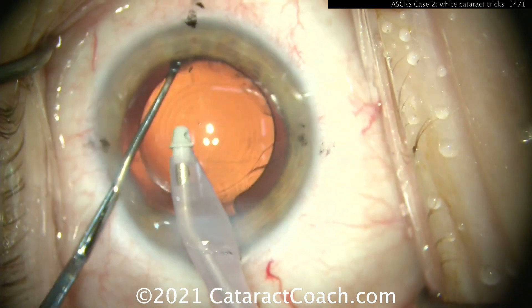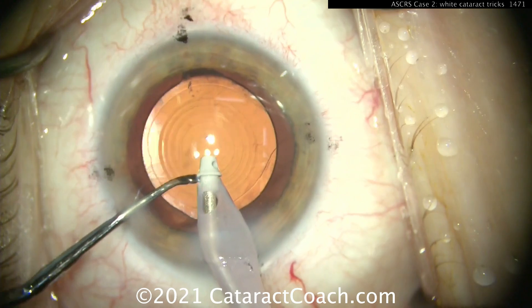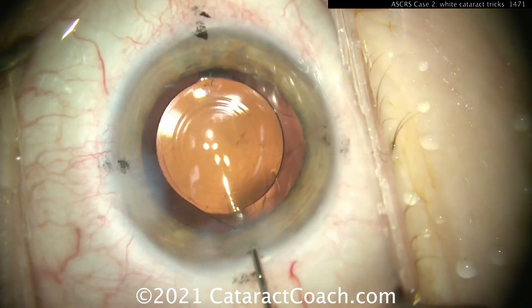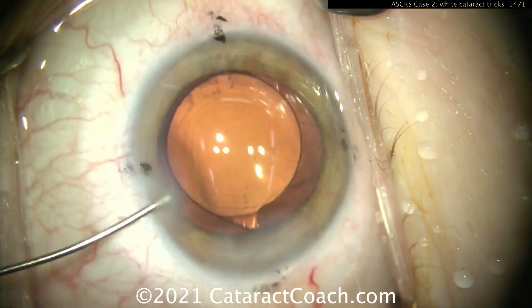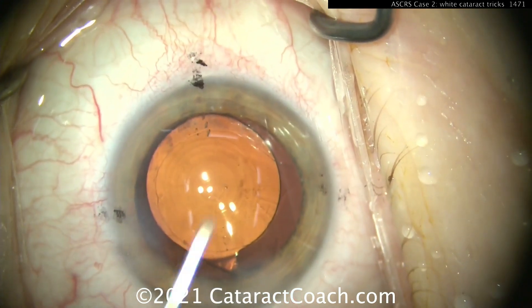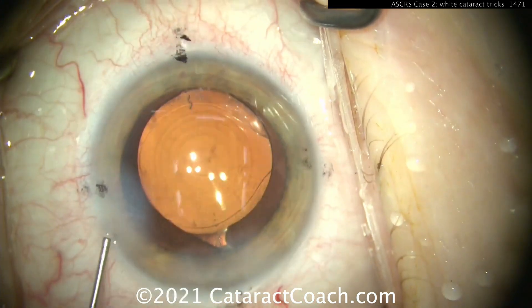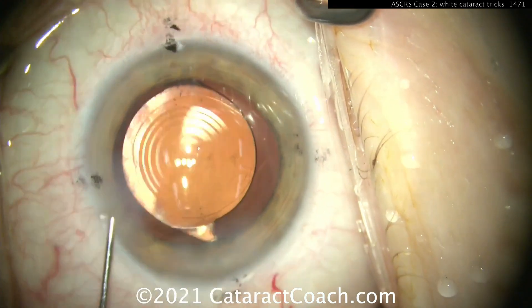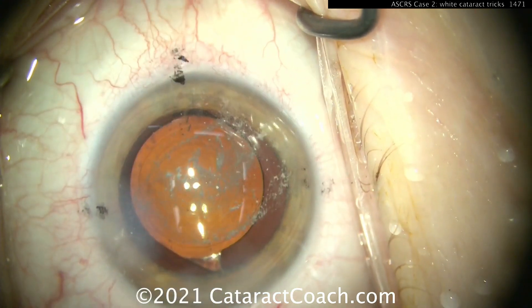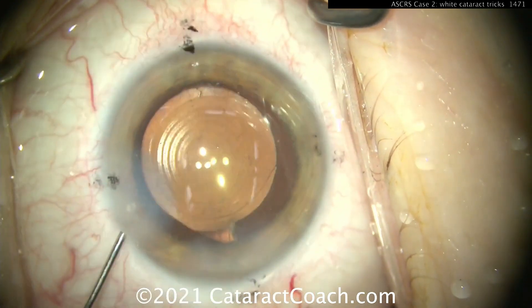Be gentle here. Remember: don't let the AC collapse — you want to keep that lens in position and keep the AC pressurized. In my left hand I'll switch to BSS on a 27-gauge cannula and inject as I come out with the IA probe, keeping that eye nicely inflated. Do not let the AC collapse and you can get out of here without any issues. A little angle sweep at the end just to make sure the viscoelastic has been removed. Lens in pretty good position — don't fidget with it too much, leave well enough alone. This patient has a very nice outcome. You can and will run into capsular issues during surgery, and you want to make sure that you have the skill set and the pearls — these white cataract tricks — in order to finish the case successfully.